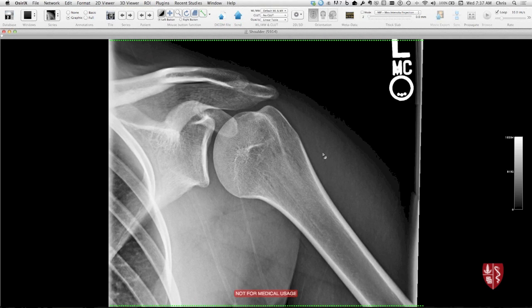This is more of a Grashey view where we oblique the patient and shoot down the glenohumeral joint so you see the cartilage space well on that view. The humeral head is also in external rotation here so you see the greater tuberosity along here, lesser tuberosity along here, and then in between those two is where the bicipital groove is, where the biceps tendon comes up and inserts on the supraglenoid tubercle. AC joint here, coracoid process coming out and projecting over like so.